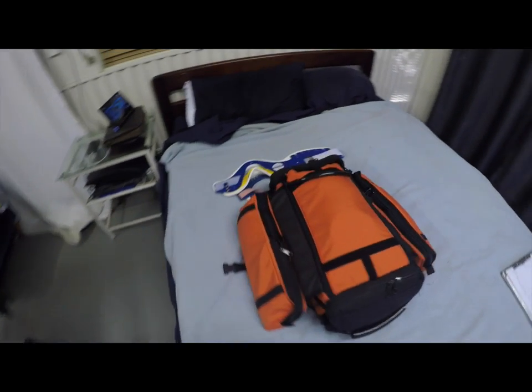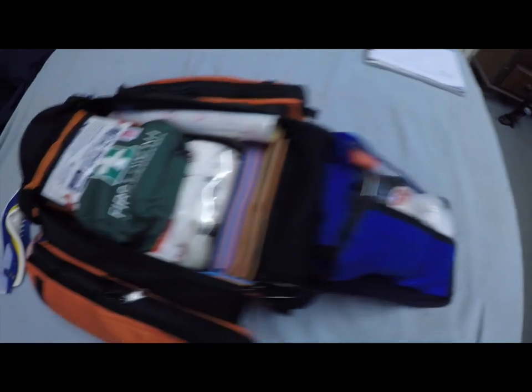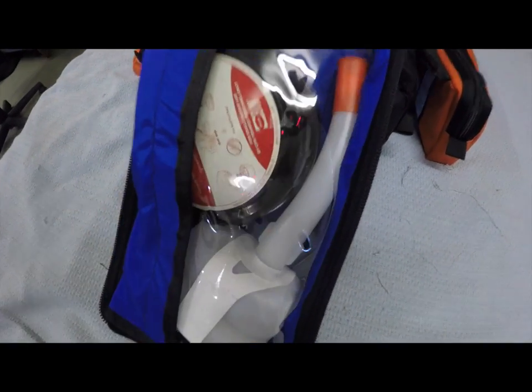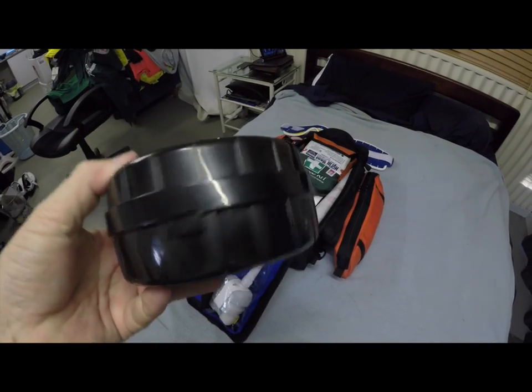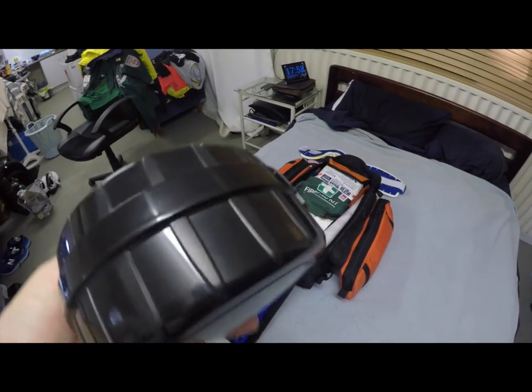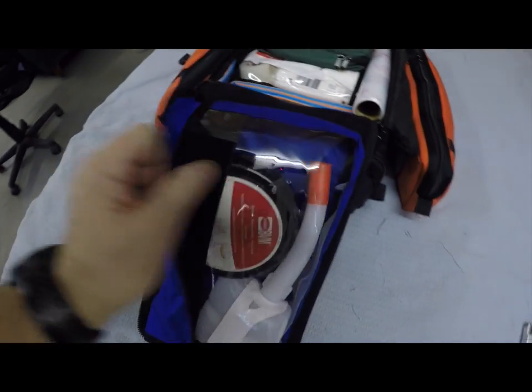I'll stop it there while I repack those bags, and then we'll open the big bag and see what's inside. Now we're back with our Conterra trauma pack and we're going to look inside. This bag has a two-ring double-zip pull-down which is really handy — you just unzip it and pull down to open it up.